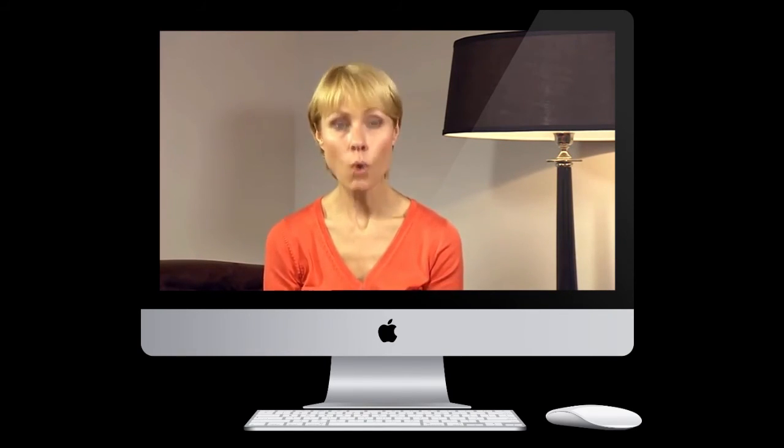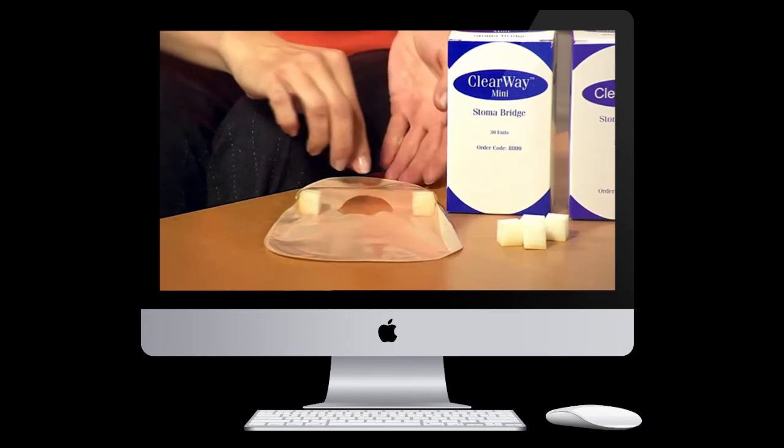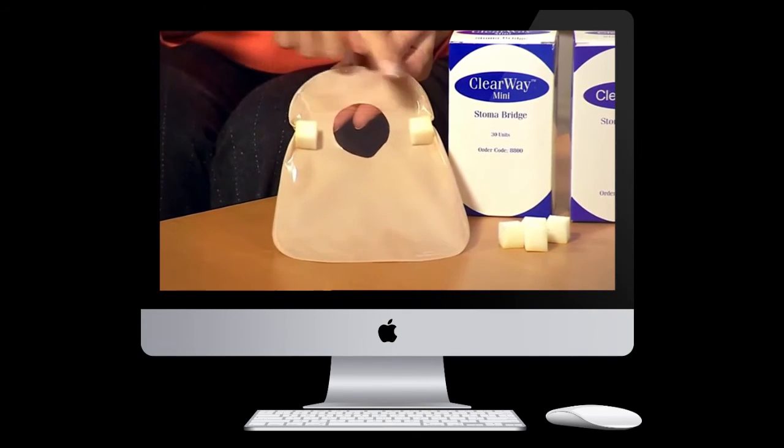To use the Clearway stoma bridge, release the backing paper from one bridge and affix one to each side of the aperture, as you can see demonstrated here.